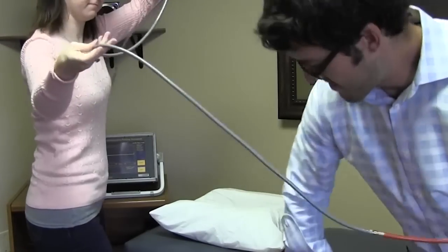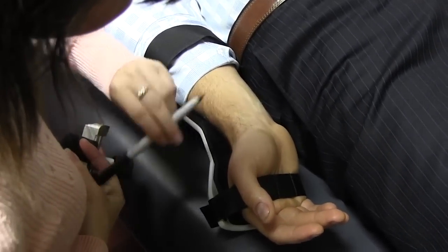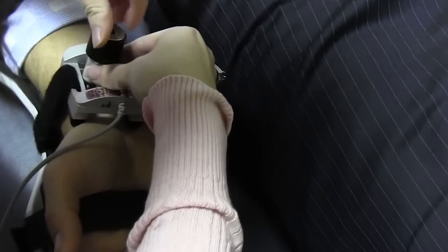Well, I'll tell you, I met with the company and they explained to me what the problem is. It's not a problem for us, but there is such a processed, automated healthcare environment now, where they want to get the patient in, process them, and get them out the door in 15 minutes, and have the whole plan taken care of, which is the opposite end of how we do things. But to put the test together, and you'll see there's micrometer adjustment on the sensor where it's placed on the blood vessel in order to get the acoustical reading on it. That takes a little finessing. And in the bada boom, bada bing world here, in healthcare, it really is a counterculture kind of test. It's a change of pace for what they're accustomed to doing, and so the machine winds up sitting in a corner. Unfortunately, it's an excellent test, and it's not done, mostly for that reason.